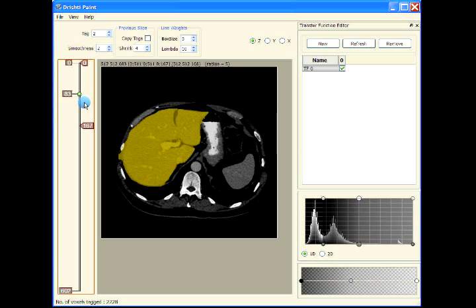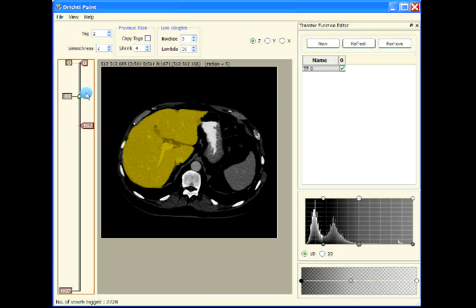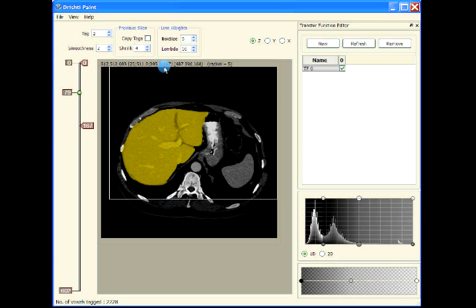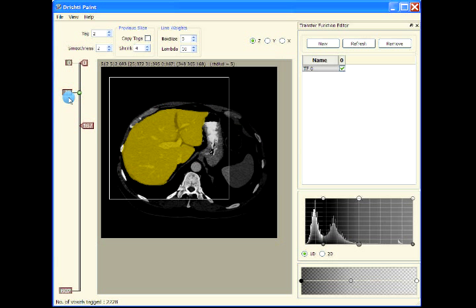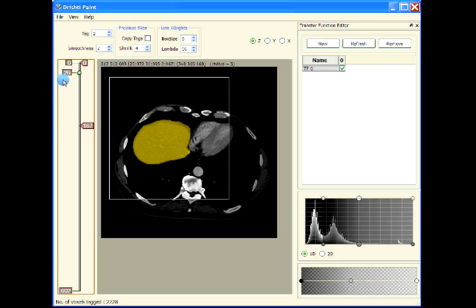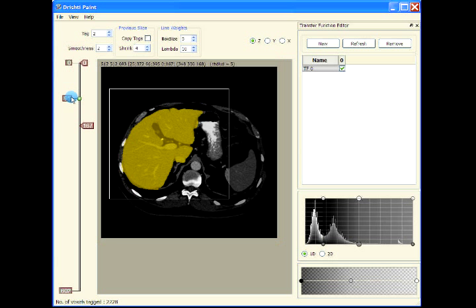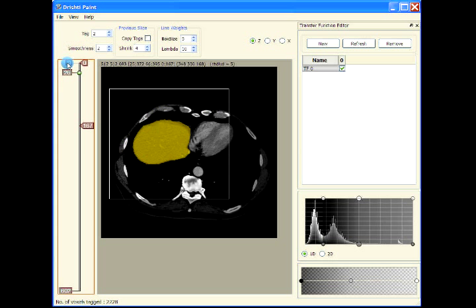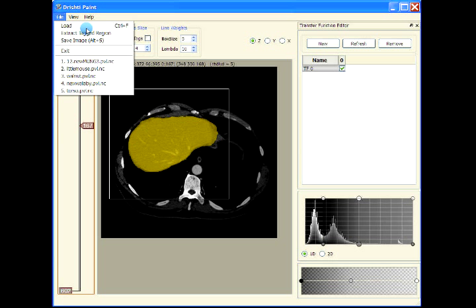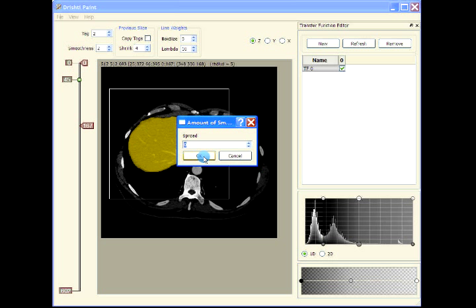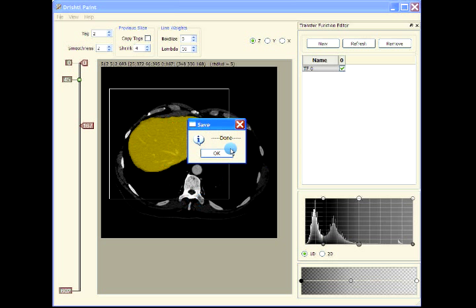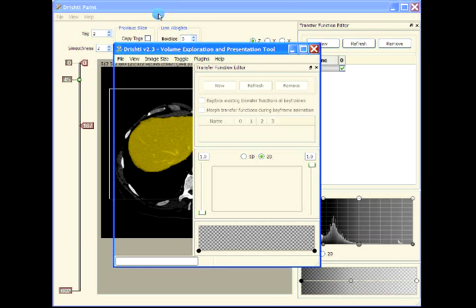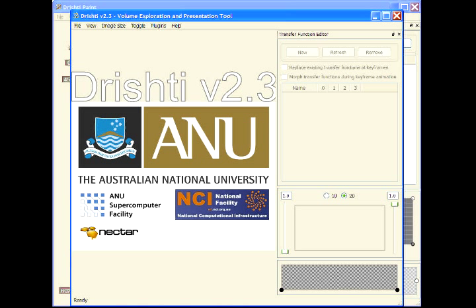This is the liver. Now let's extract it. I'm using Alt and left mouse button to select this region here. Let's extract the tag region. This is tag number two, so let's use tag number two. We don't want to apply smoothing or spread. Let's save it as liver. It's done. Let's see how it looks in the render.